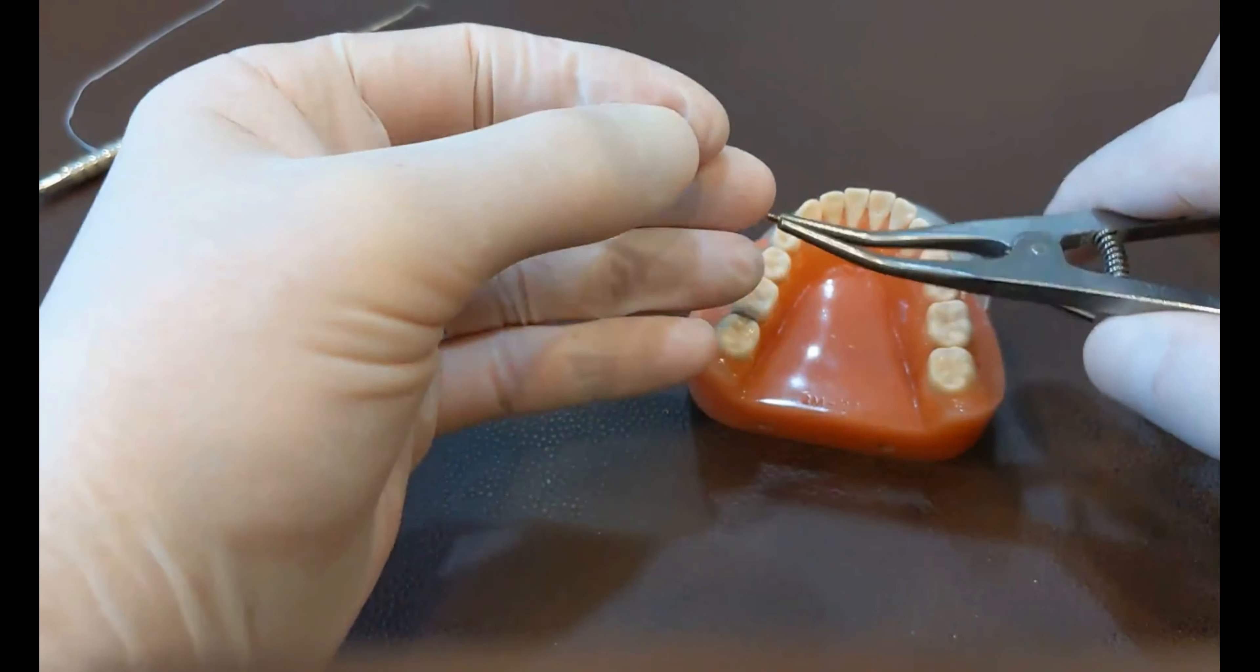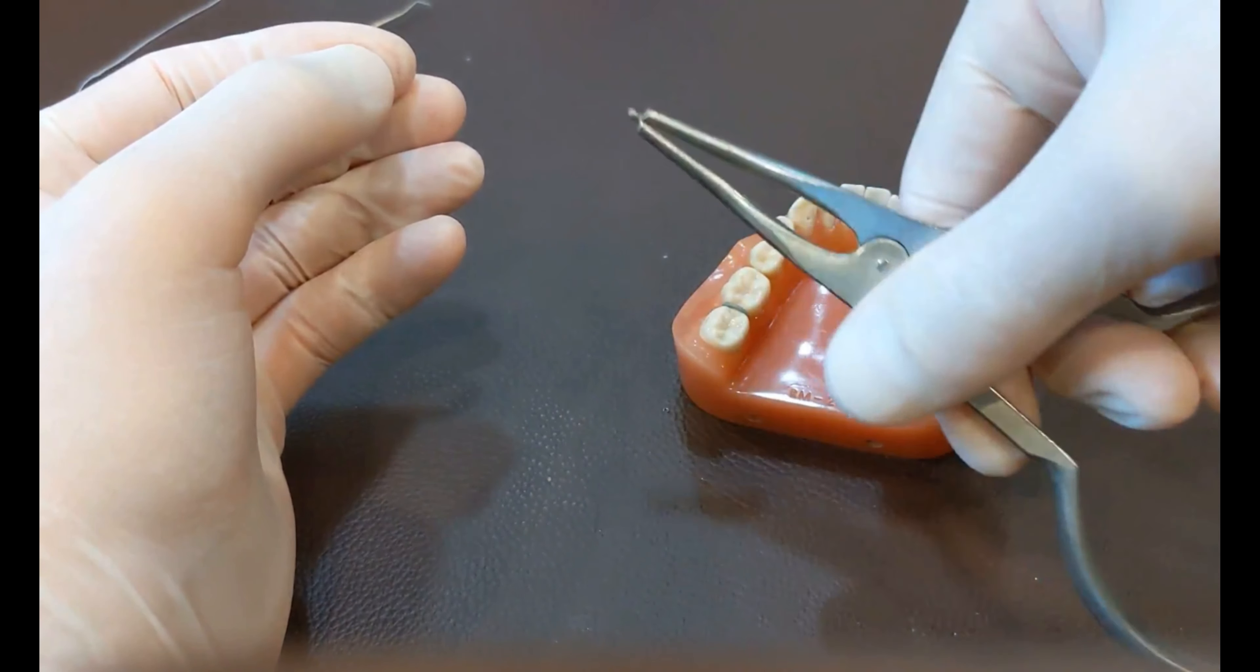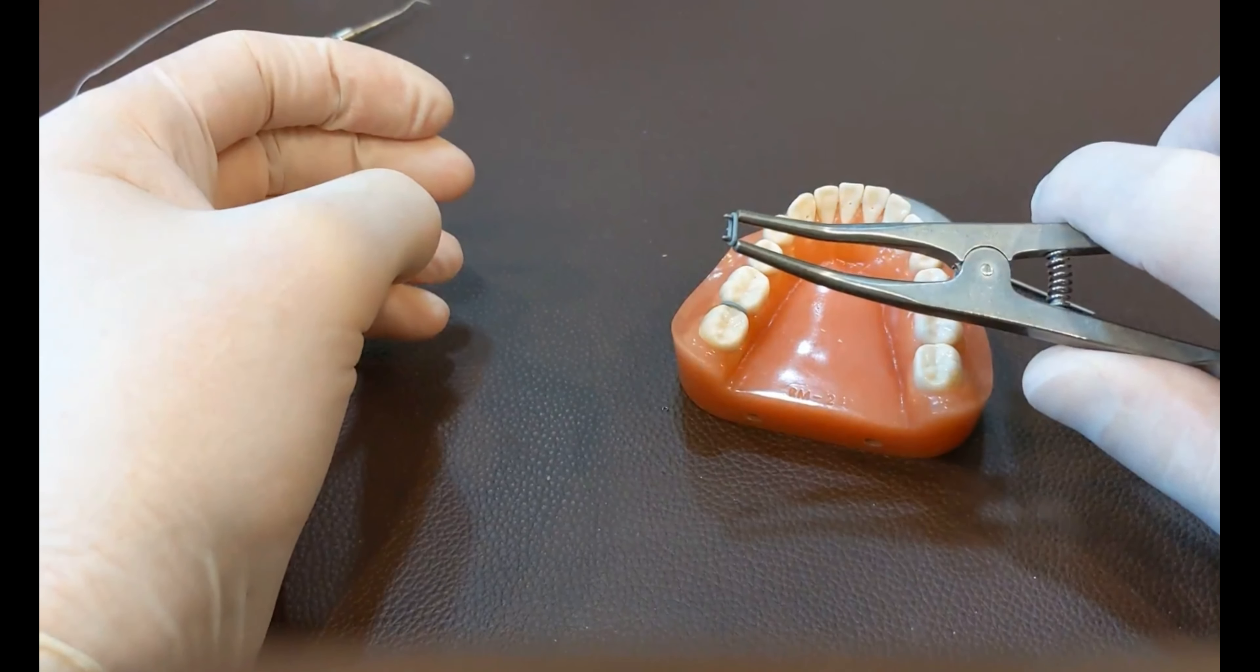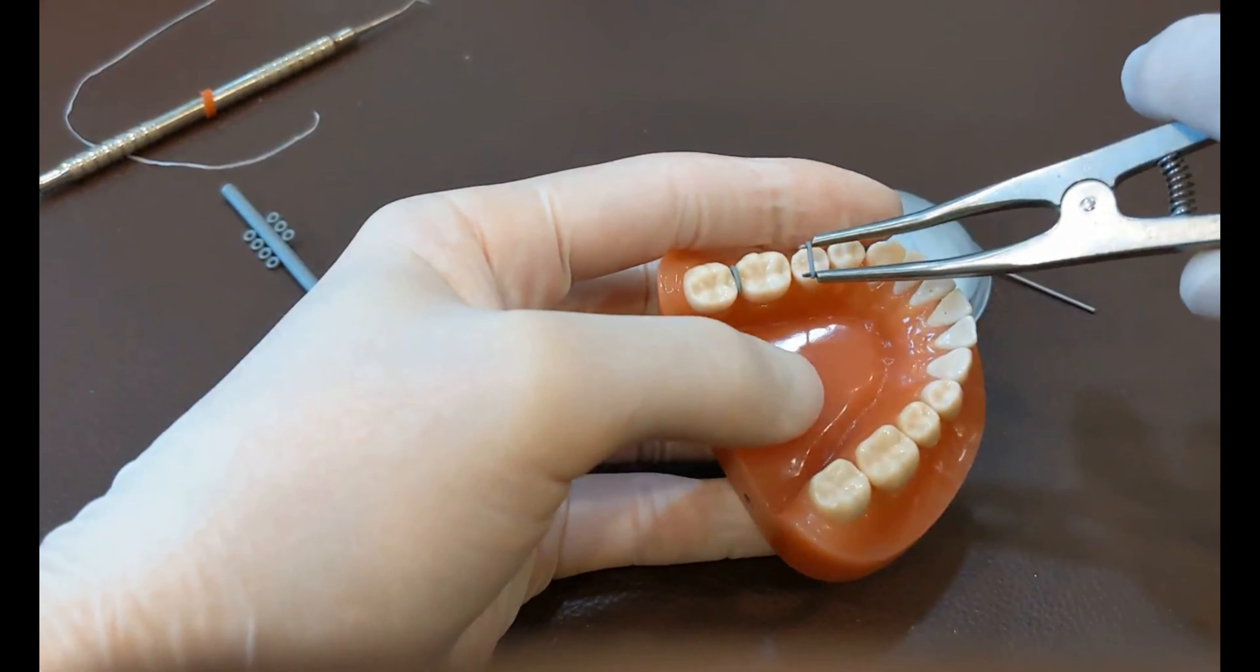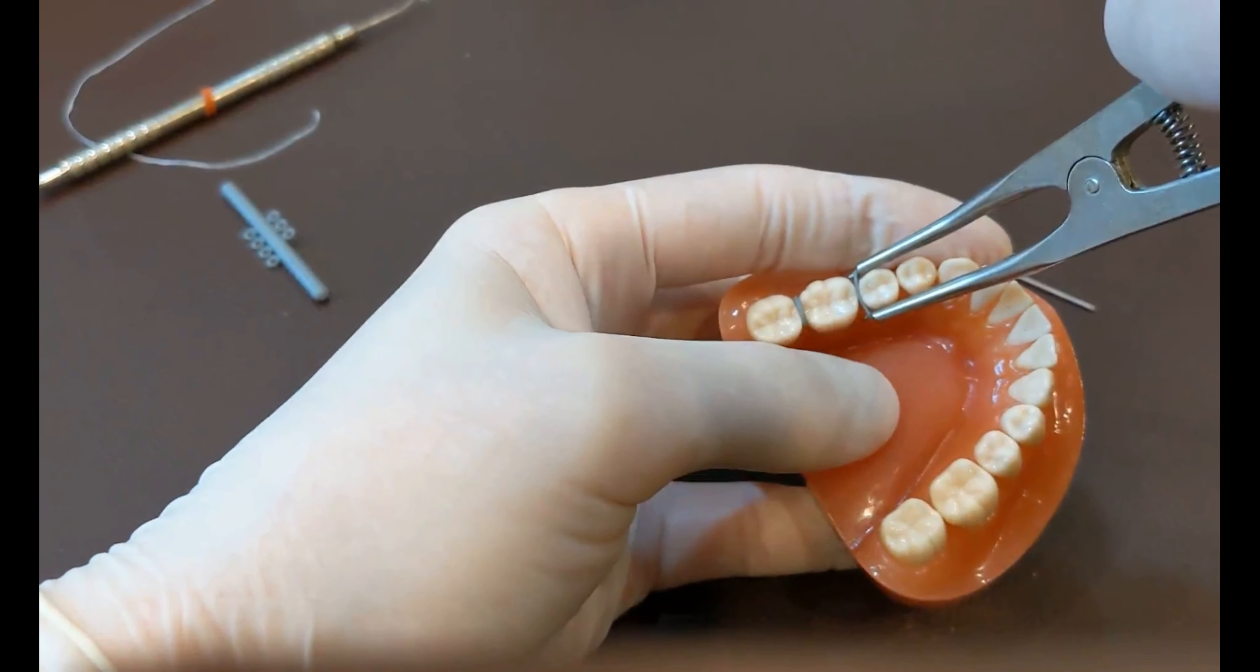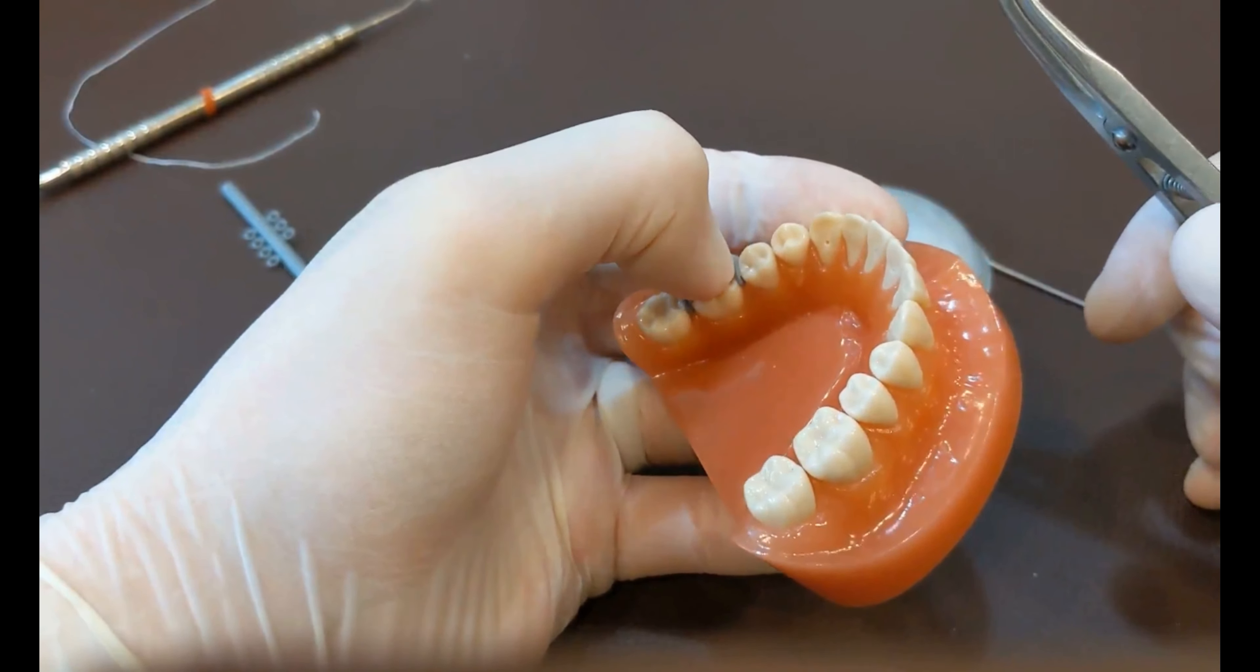The second way to place a separator is with separator pliers, which look like this. So what you do is you get your separator, you put it on here, and then as you gently squeeze, it opens it up a little bit. So the idea is, you get it in here, you open this up, and then you push down so that just half of the separator goes below the contact. And then you let go and make sure that it stays in there.